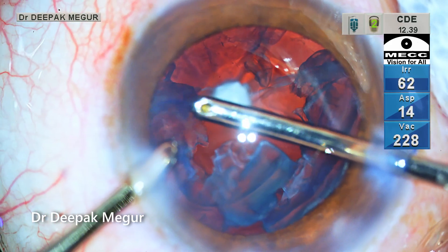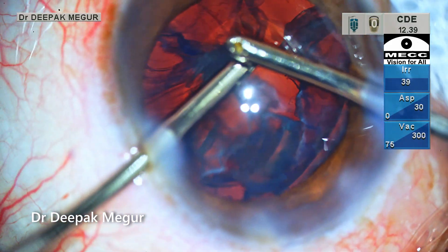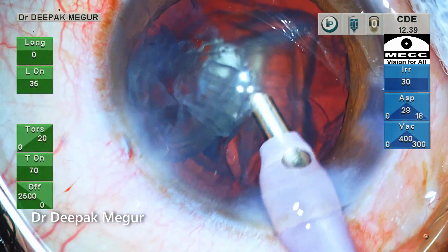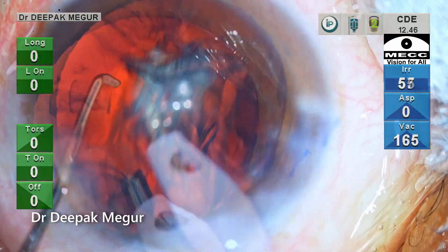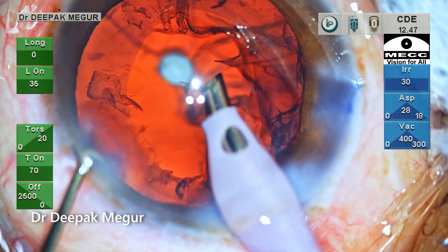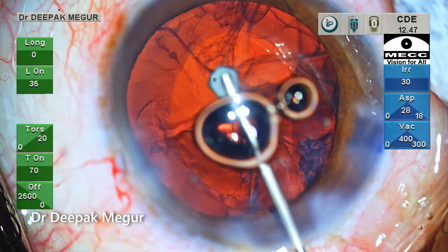The cortex is being peeled off and consequently the epinucleus is pushed towards the center. The thick epinucleus is difficult to aspirate through the bimanual aspiration cannula, so the phaco tip comes into action again and the epinucleus is aspirated quickly and efficiently. Before removing the handpiece, OVD is injected into the chamber again.